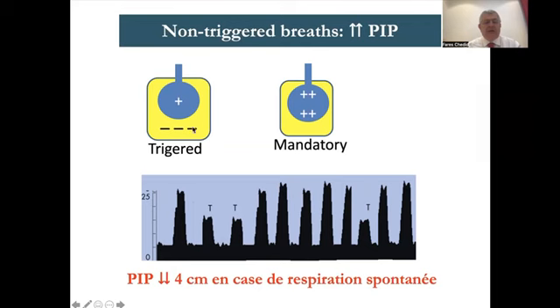Triggered breath, this is the alveolar pressure. The patient took too much negative pressure, so the machine doesn't need to give much pressure. A triggered breath would need much less PIP. It was demonstrated that a triggered breath needs a PIP of 2 to 4 centimeter water less than a non-triggered breath. Here is a patient who didn't trigger at all because you sedated him a lot, or paralyzed him, or put a respiratory rate too high, so he didn't have a chance to trigger. So the machine will have to do the whole effort, and produce 2 to 4 centimeter water more when the breath is not triggered.